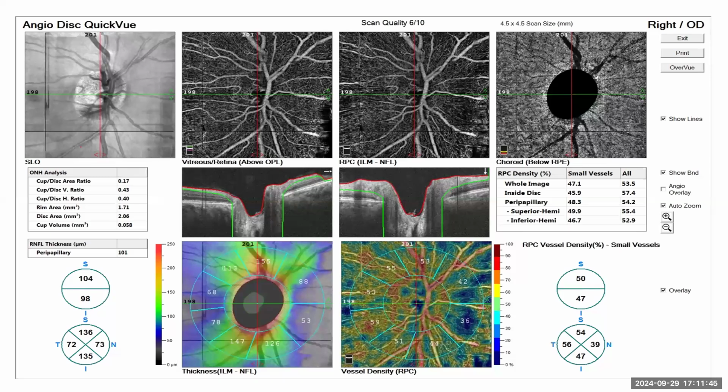If this patient is going to be placed on close monitoring, you have to reassess this vessel density, given a timeline of, say, 3 or 6 months for a judgment call. If you still have a further reduction in vessel density and there are no systemic vascular risk factors, then it begs the question of what do we do here and now?